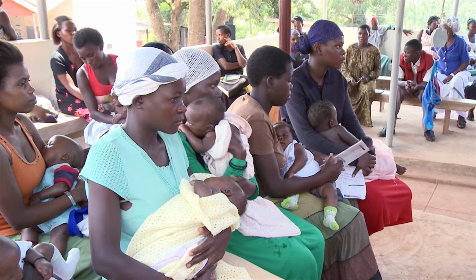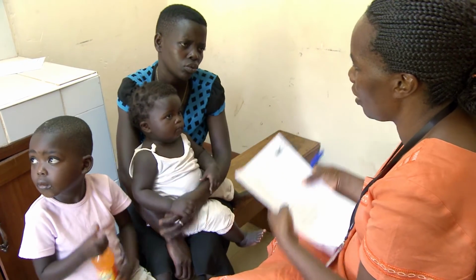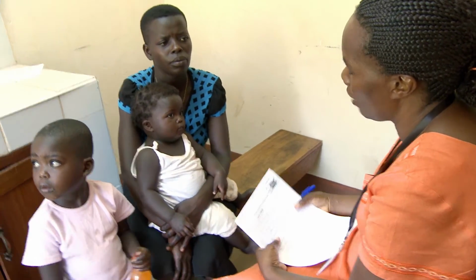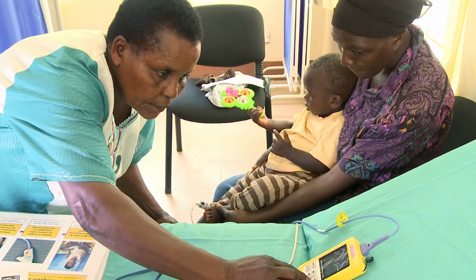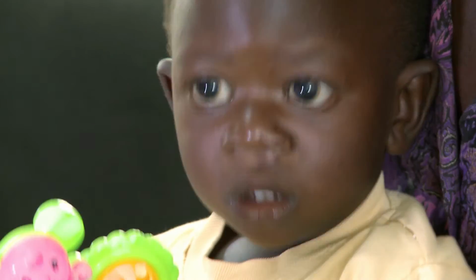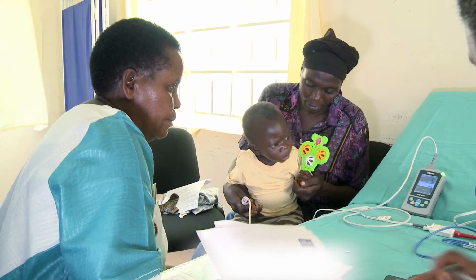Well, the process is such that the children with their caregivers would present at the hospital, and then after being registered, the hospital staff then referred them to our research nurse, who is responsible for the screening and consenting of the caregivers. The assessors conducted assessments using either two or three devices and took two readings for each device.